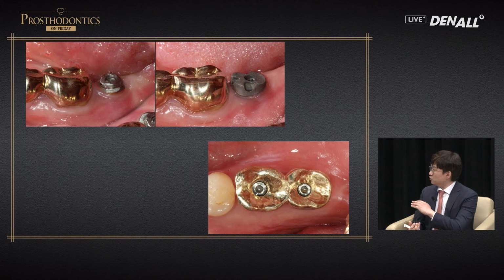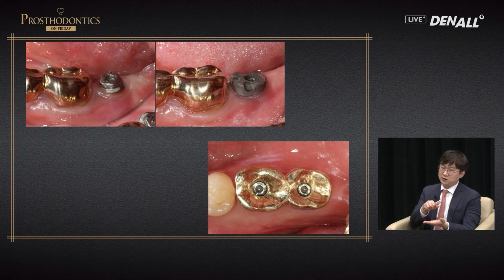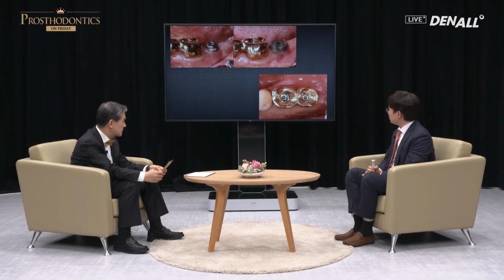Another approach is the gold UCLA abutment. From the abutment to screw, the distance can be short for this type of prosthesis, but gold is expensive. Cobalt chrome or molybdenum type of metals can be used, and that is called MP cast. Such metal can be cast. However, the material of abutment connection and implant material are different. Therefore, oxide film is a concern. Implant level screw type, this approach is not used by me.